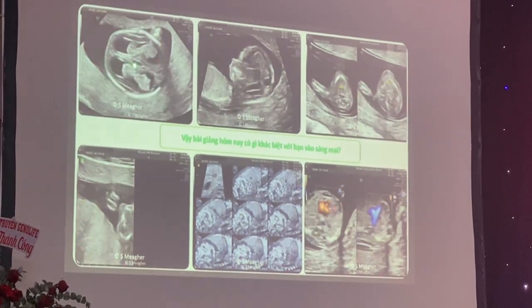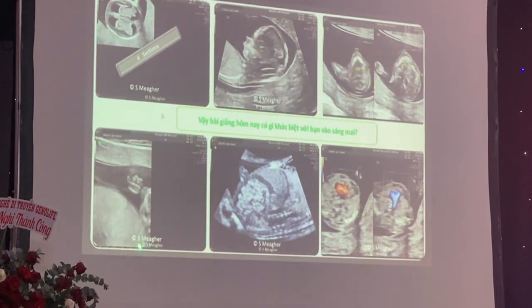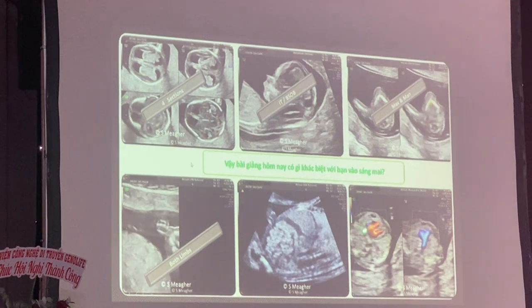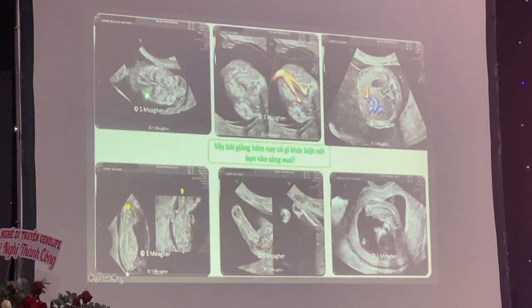First you do 4 sections. Next you look at the 3 black spaces. Then you split, showing the maxilla and the mandible. Then you split, you show the right and the left hand. Then you do a sagittal section, you show the diaphragm. Then you show the heart with the 4 chamber and the 3 vessel tracheal view. Next page. Then you go on to play the clips, please.